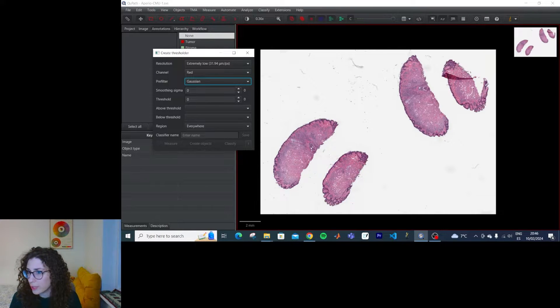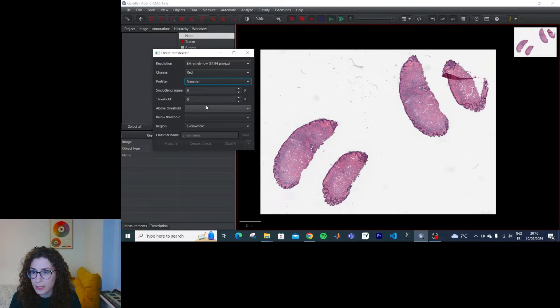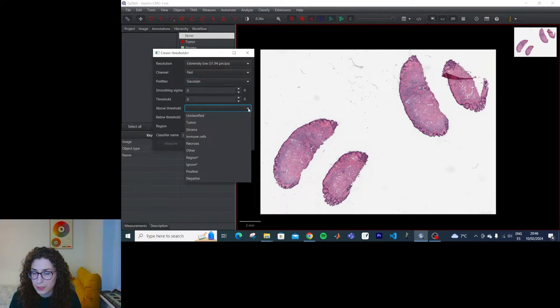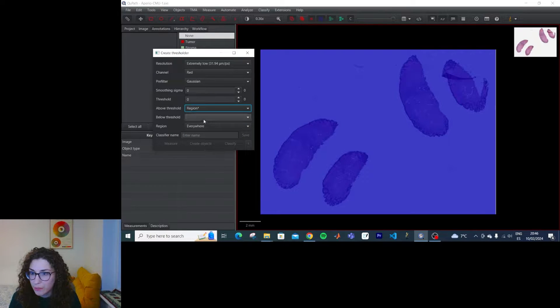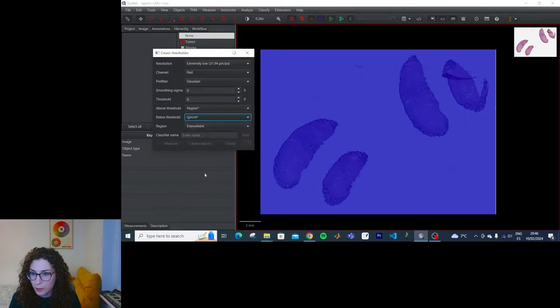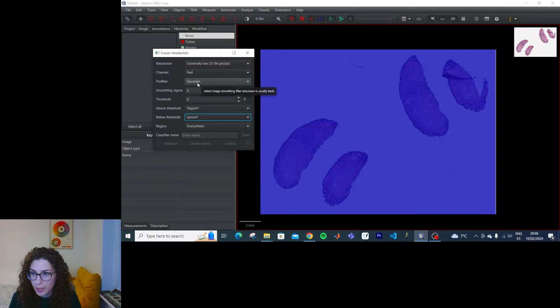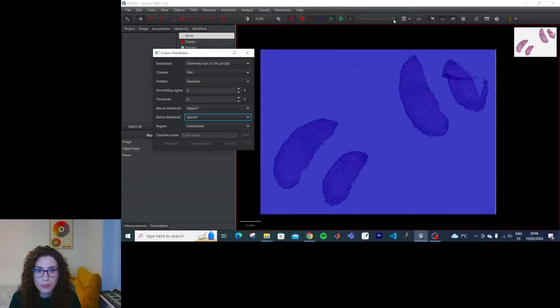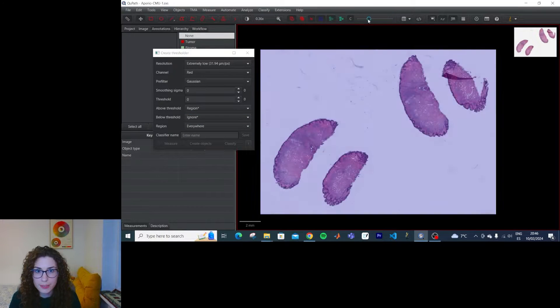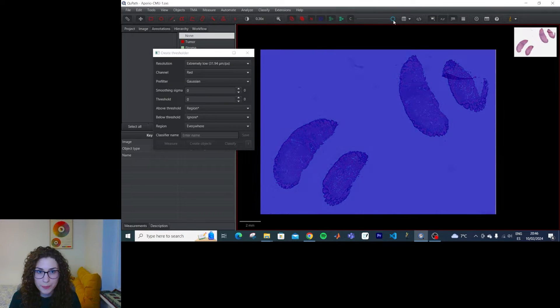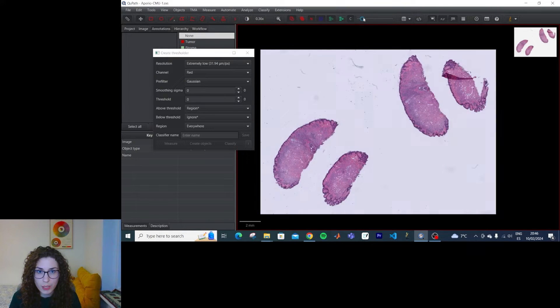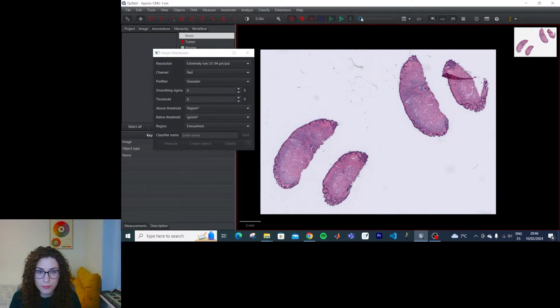So let's say that above threshold is going to be region, and below threshold, ignore. Okay, and then we have this slider here that we can use for visualization.